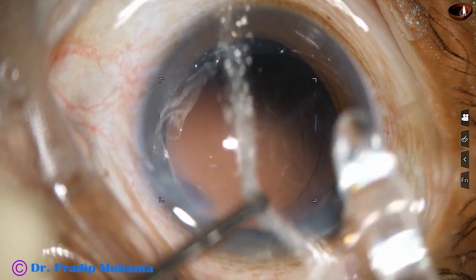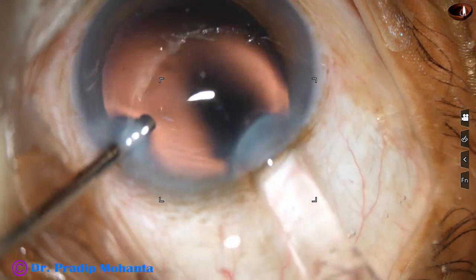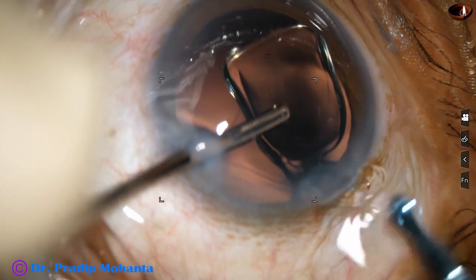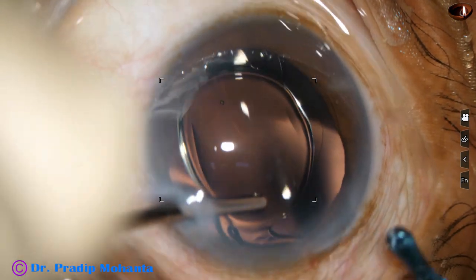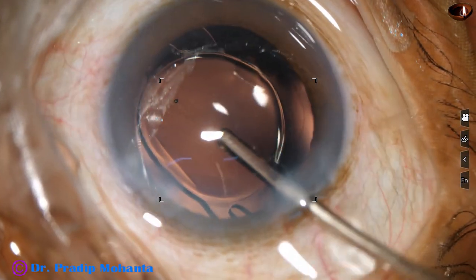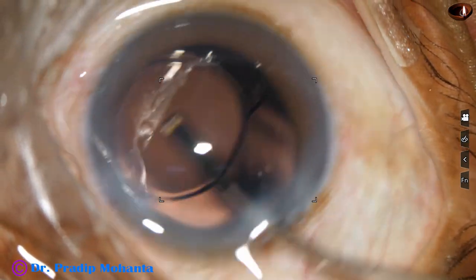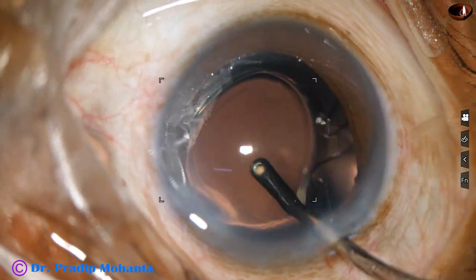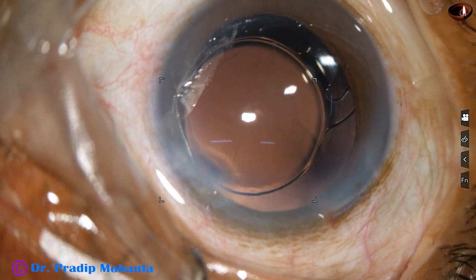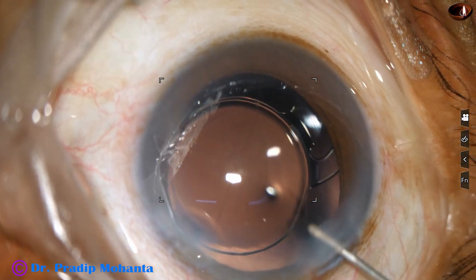Now this is hydroimplantation of a single piece monofocal intraocular lens. This patient could not afford a hydrophobic lens, so this is a hydrophilic acrylic single piece monofocal intraocular lens. This is irrigation of the anterior chamber, irrigation of the bag to remove some visco, whatever visco is there in the lumen of the cartridge.